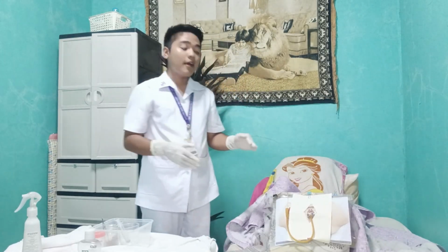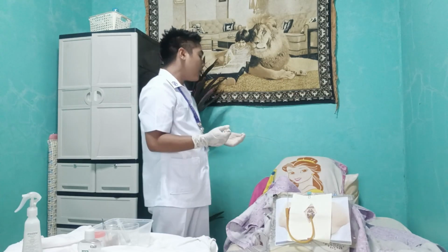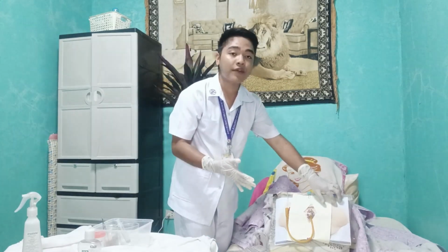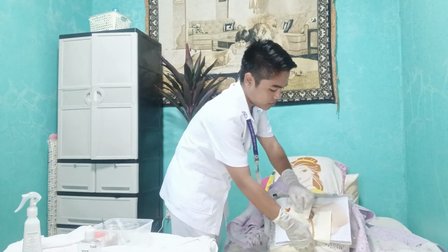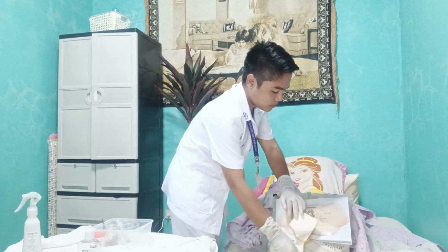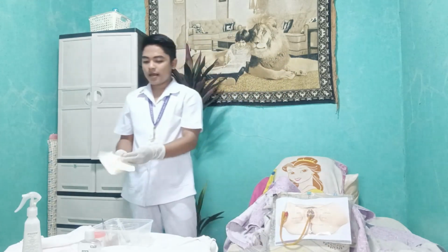So now we're done with the procedure. Now let's remove the eye sheet. Okay, that's it, and throw it into the proper receptacle.